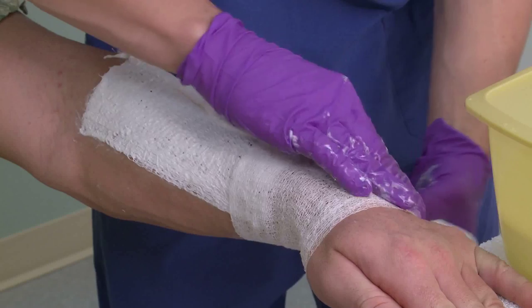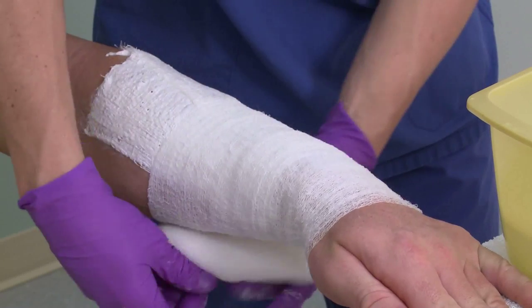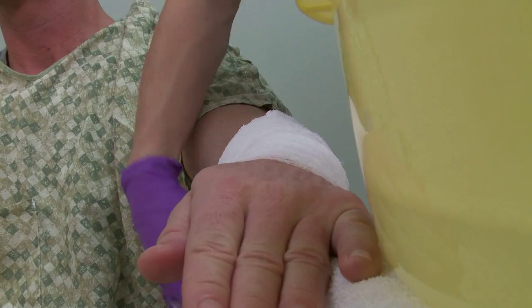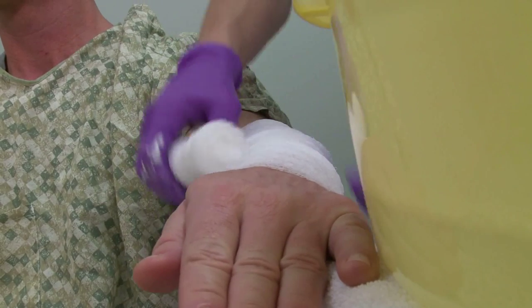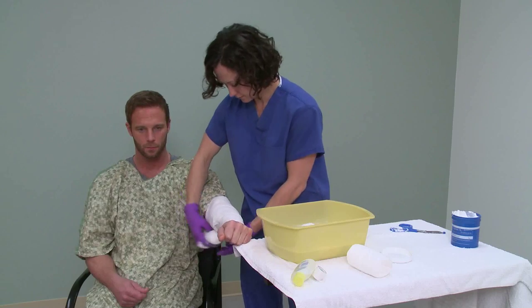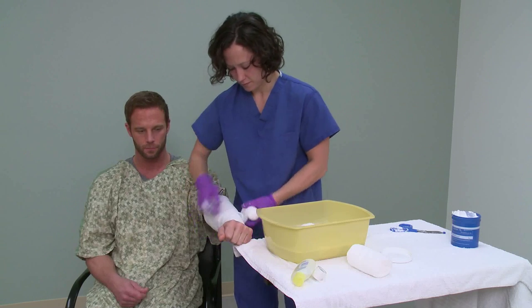To protect your dressing, now wrap it with a roll of dry gauze. When wrapping arms or legs, always start from the outermost end and wrap upward toward the body. For example, start at the toes and work your way toward the knee, or start at the fingers and work toward the shoulder.